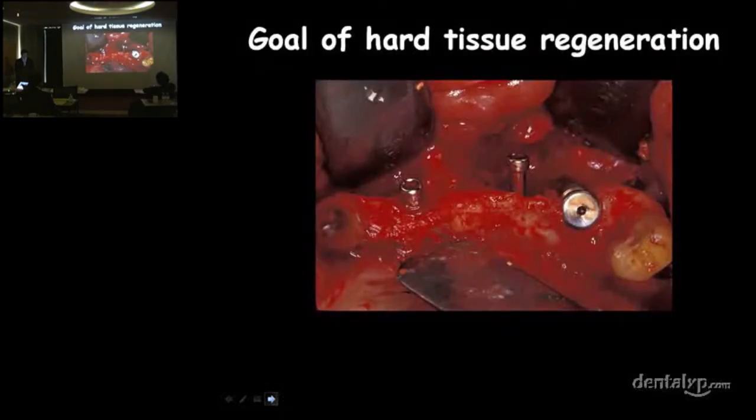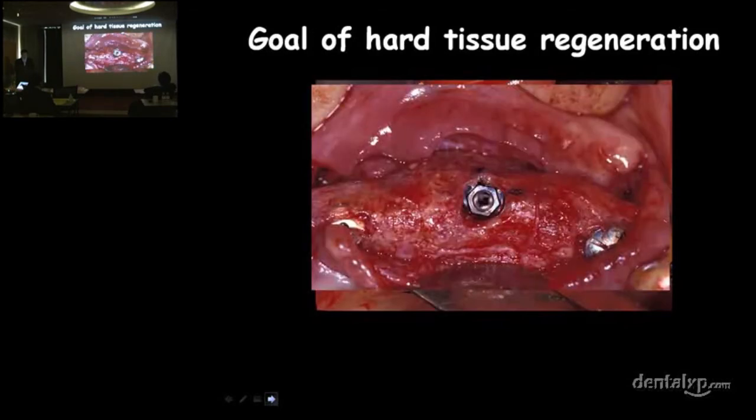This is the occlusal view during bone augmentation. Typically, we must ensure that there is at least 2 mm bone thickness on the labial side of the implant. If not, compensation with soft tissue will be necessary.